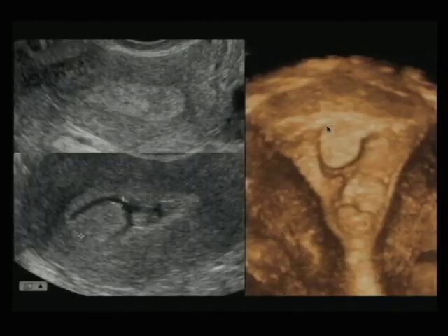Here's another patient. And in regular 2D ultrasound, you really can't see why this endometrium is thickened.